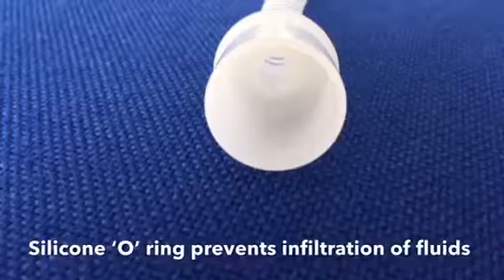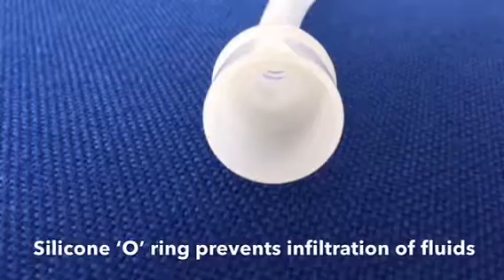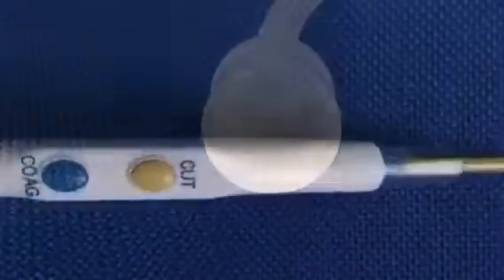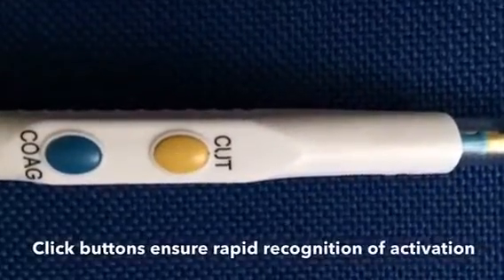The impermeability is guaranteed by a special silicone o-ring that prevents the infiltration of fluids and protects the operator from electrical shock. The click buttons ensure the rapid recognition of activation.